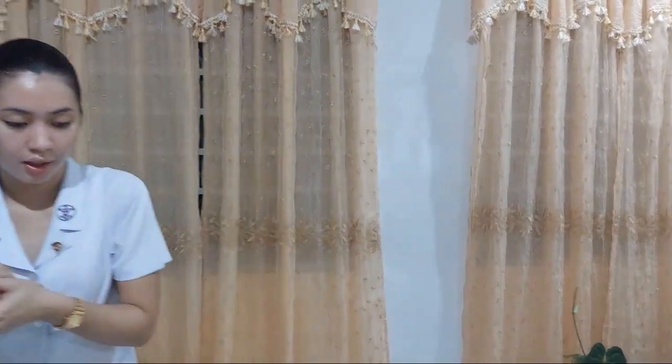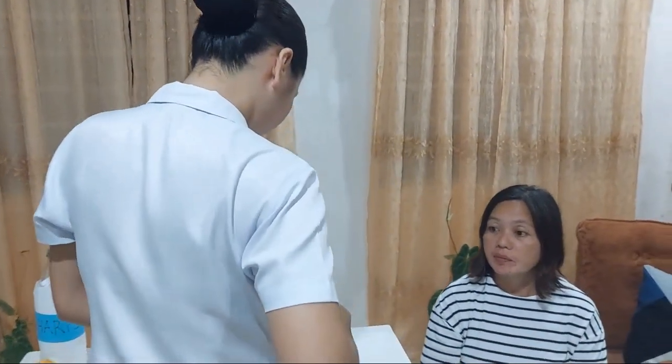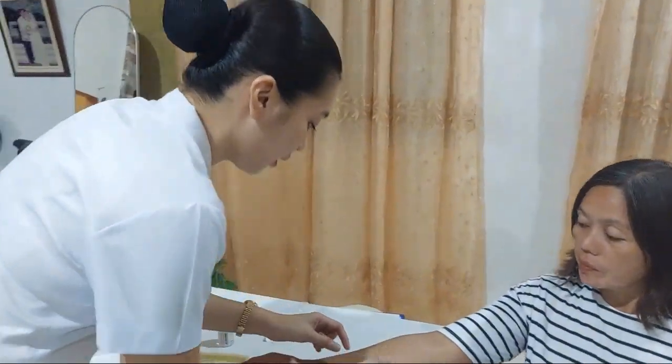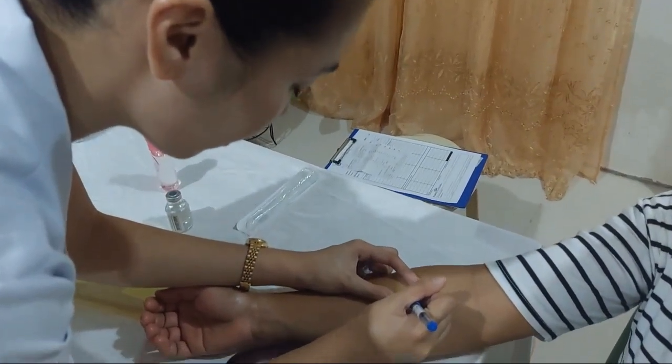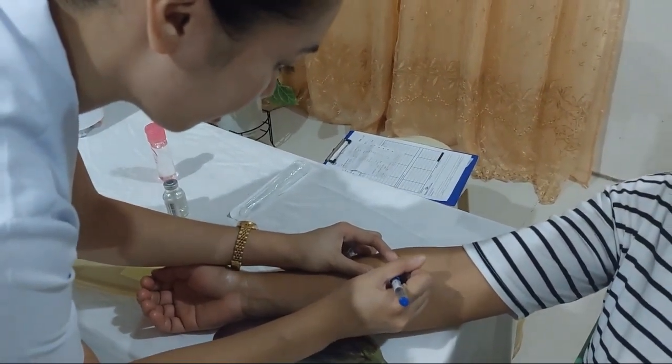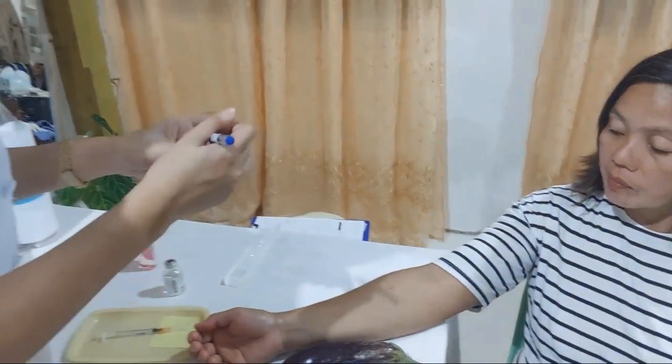Okay, to that, I'll be drawing, or tracing, the blister, as if we know that there is a blister here. Please don't massage the site of injection, okay? Because it will disperse the medication into the other tissue. So don't massage that. And to that, now I'll be heading out. Do you have any clarification?